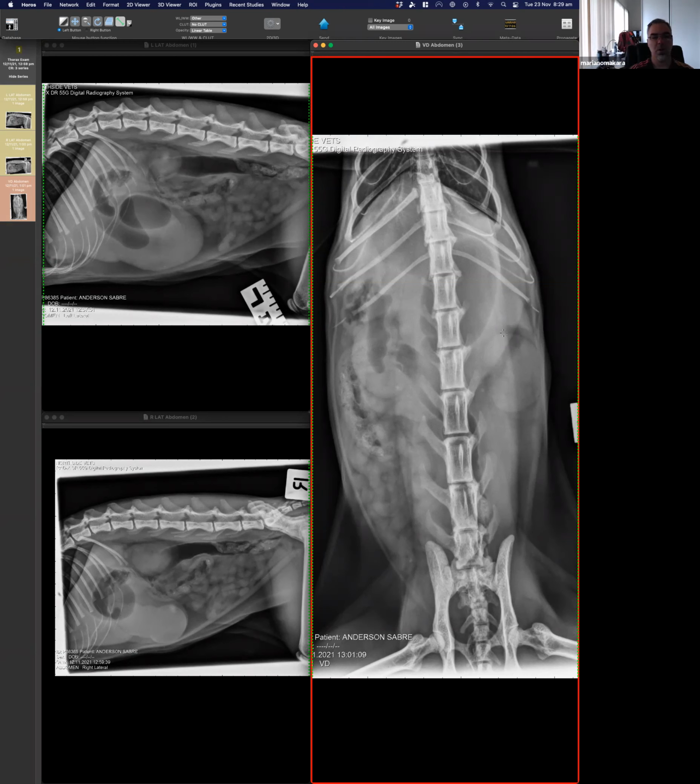It's in the duodenum. The supportive evidence is that the stomach is very severely distended. The small bowel is very empty. So then there is something that looks abnormal where the duodenum sits. So that's the description. That's the argument to conclude that there is a mechanical obstruction. So if the reasoning to go on in an ultrasound is to prove that there is an obstruction, my answer is no.